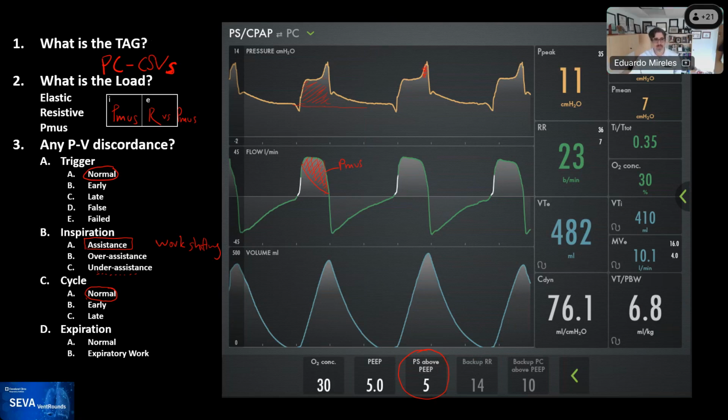So here comes Eduardo's trial on patient, okay? So I grabbed, this is the patient, exactly the same patient, no different, okay?